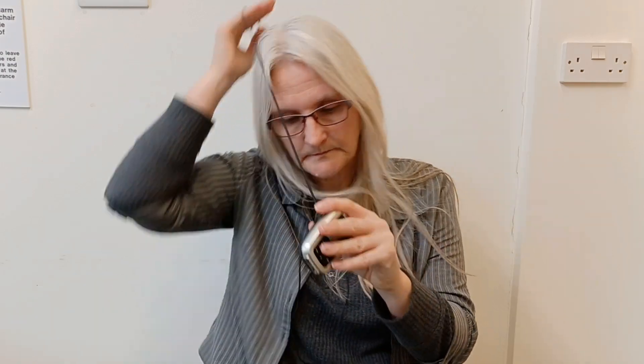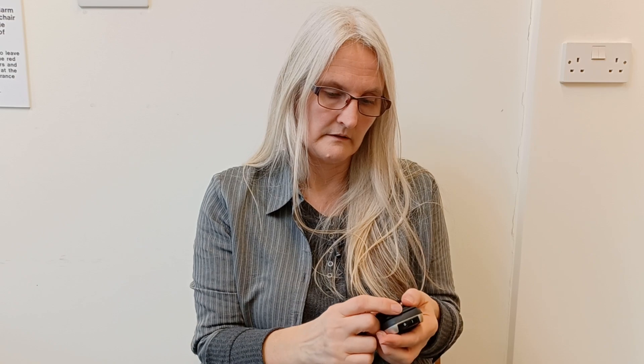If you don't want to use the neck lanyard, you can replace it with the belt clip. The belt clip slides on at the back and then you can just clip that onto your belt or put it in a jacket pocket. To remove it, squeeze it and slide it off.